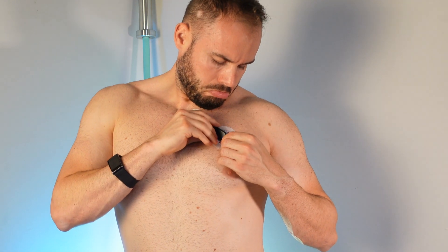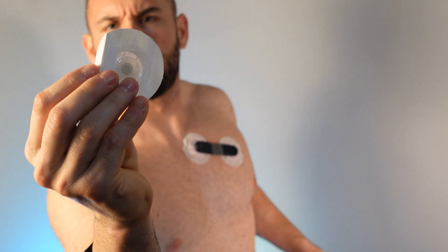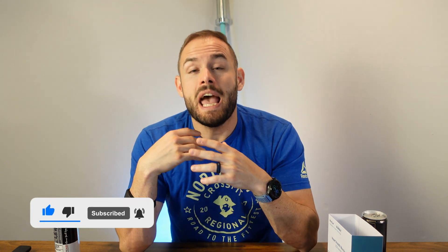If I were using this, I'd probably use the strap because those electrodes you'd have to actually buy more of — you could buy them online or buy your own, but you'd probably need to buy them through WellView. If you're looking for the most accurate readings, you want to be doing that 24-hour recording to give it a lot of extra data so the AI can analyze it. They say using the pads themselves is going to be a lot more accurate, and they recommend using the electrodes at that 45-degree angle at your chest for the most accurate reading.